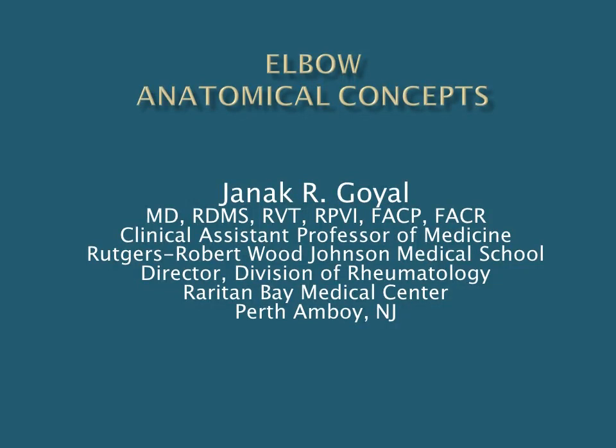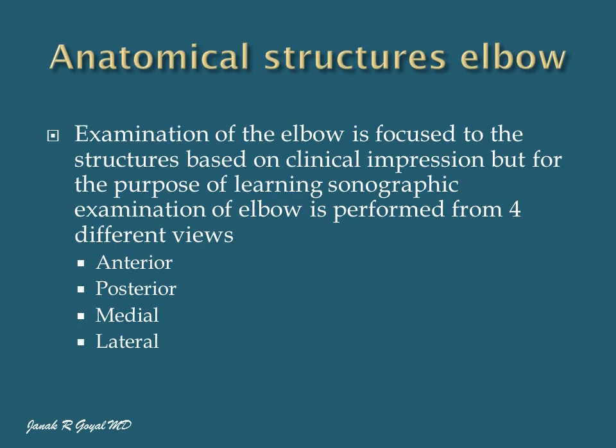In this talk, I will present the simplified anatomical concepts for sonographic examination of the elbow. The examination of the elbow is focused on the structures based on the clinical impression, but for the purpose of learning, the sonographic examination of the elbow is conducted from four different views: the anterior, posterior, medial, and lateral views.